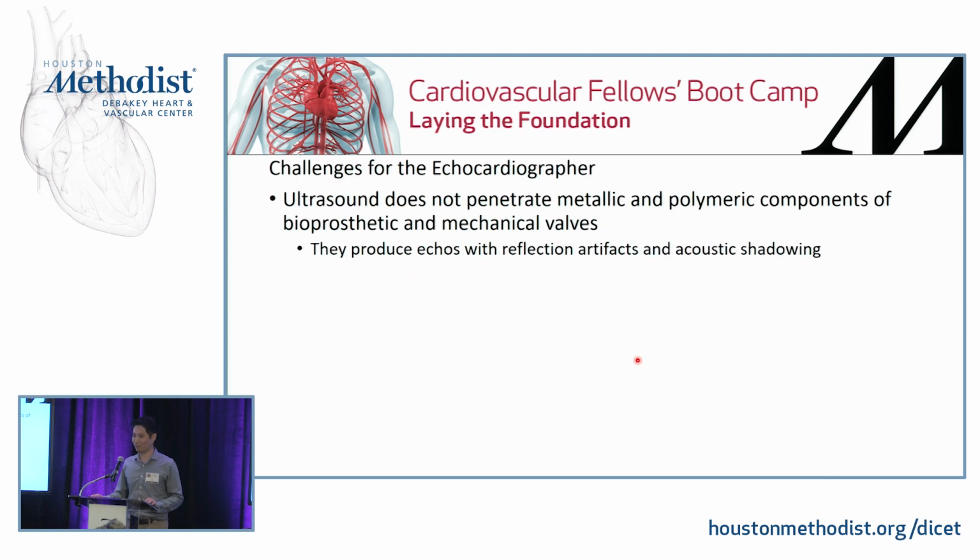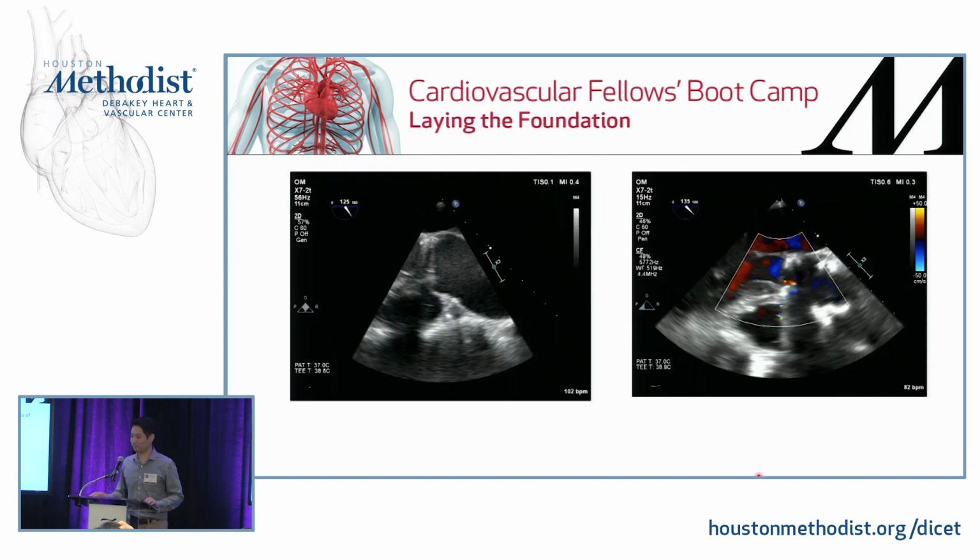Okay, so like I said before, ultrasound doesn't penetrate metallic or polymeric components of the bioprosthetic and mechanical valves. So that makes it difficult for us. So that's why we have to take our time, look at things in different views and different angles.